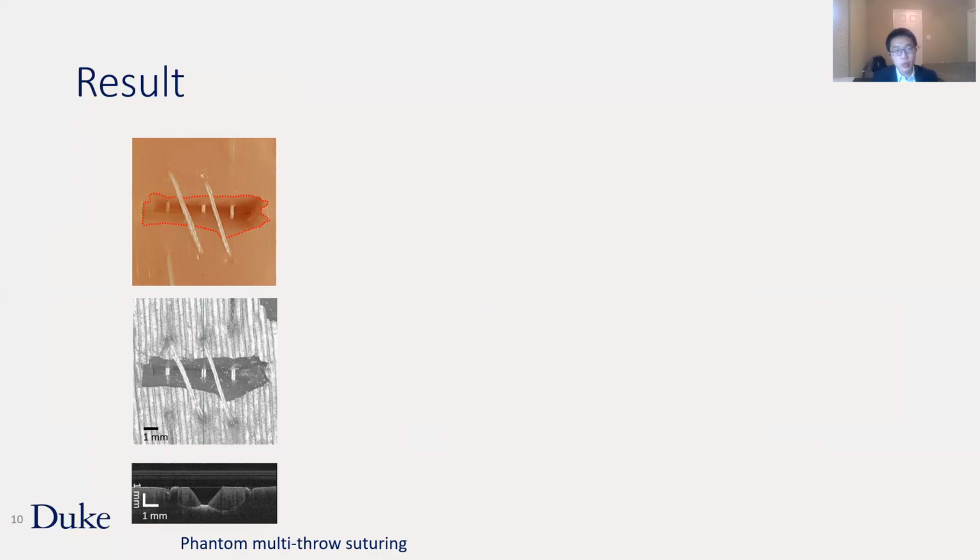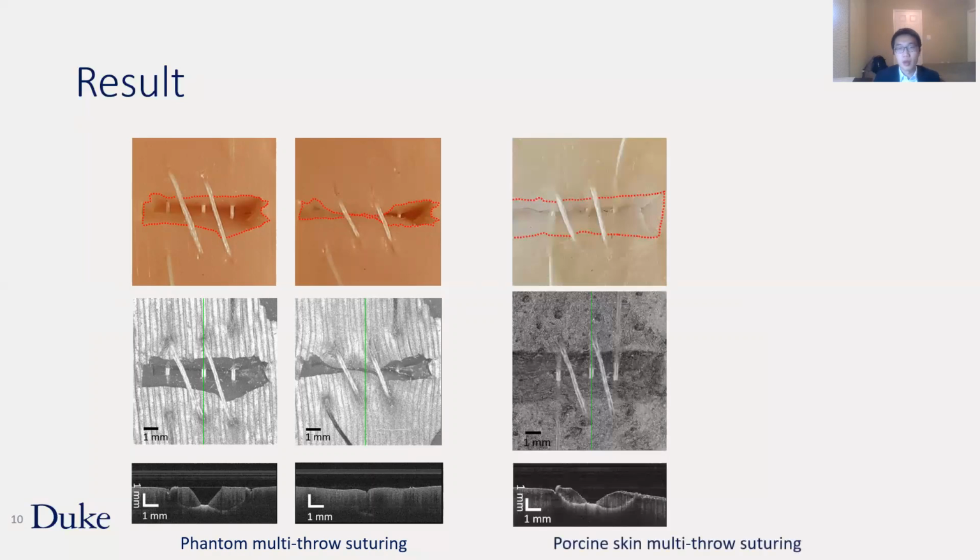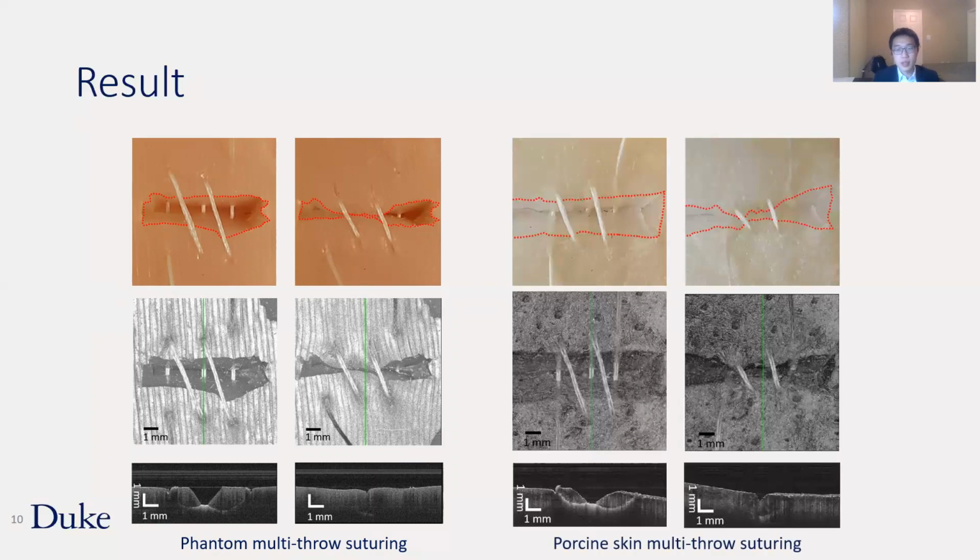After the multiple throw, we pull the 2 sides of the suture to close the wound. Between the second throw's entry and exit points, the wound is totally closed. From the B-scan view, there's no dead space after the wound is closed. We also did the multiple throw on porcine skin. After closing the wound, there's also no dead space.